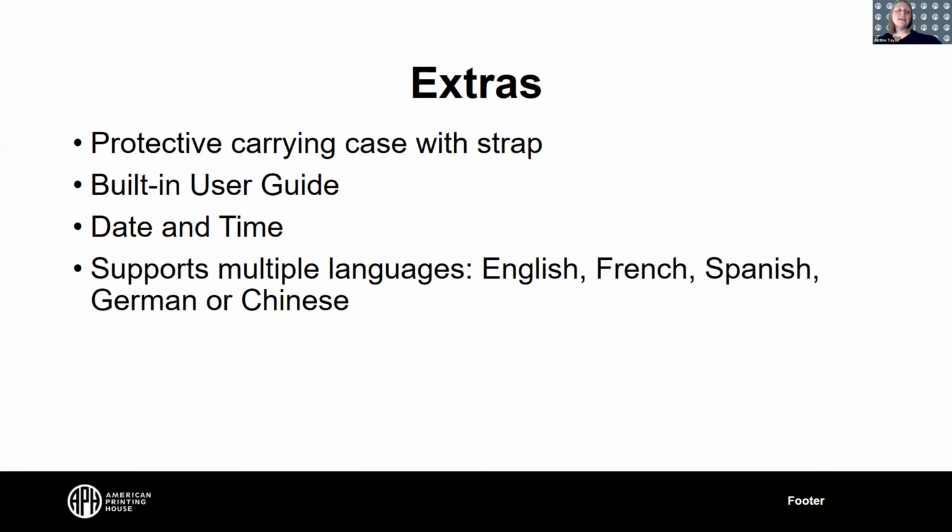Sure. So it has a nice padded protective carrying case with a strap. It has a built-in user guide. You can set the date and time, and it supports multiple languages. So English, French, Spanish, German, or Chinese are the languages you can have Juno read in.